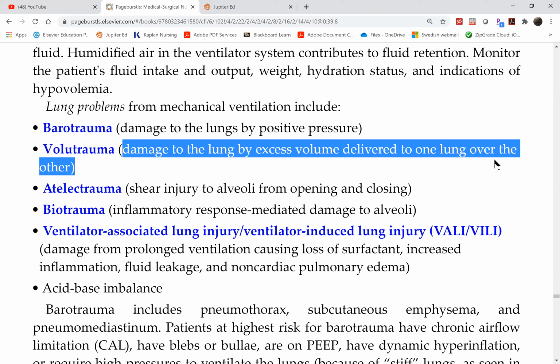The lung now cannot take 400 ml anymore, because most of it is pressure, which will rupture the lung, because it's become so stiff, but the pressure from the vent remains the same. Although the high pressure alarm will go off first, sometimes this may happen before the high pressure alarm goes.